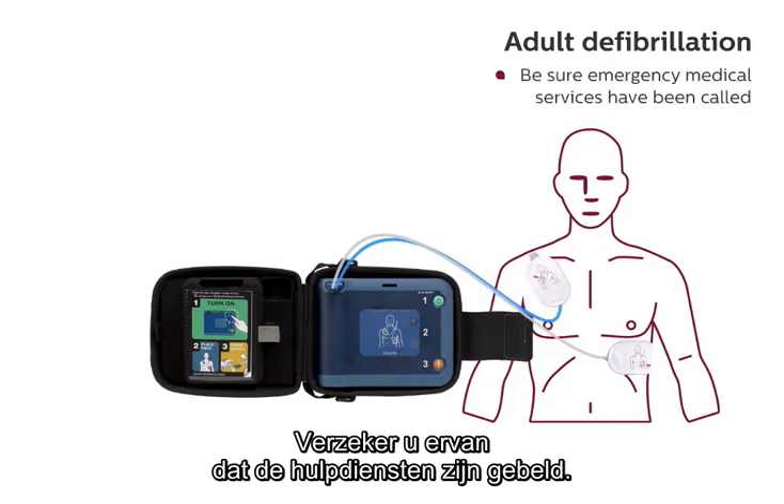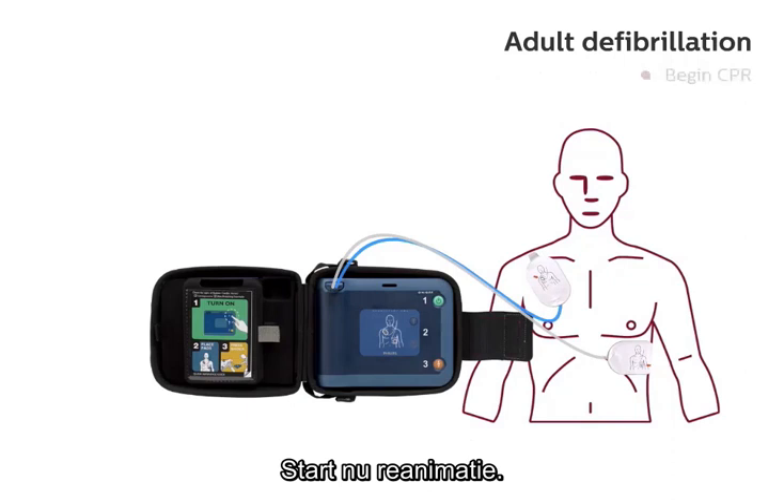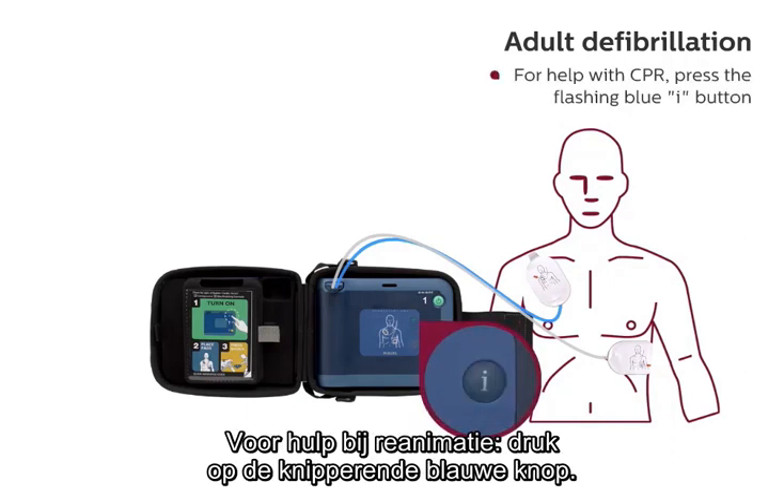Be sure emergency medical services have been called. It is safe to touch the patient. Begin CPR. For help with CPR, press the flashing blue button.